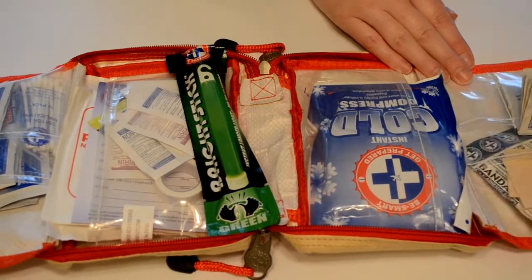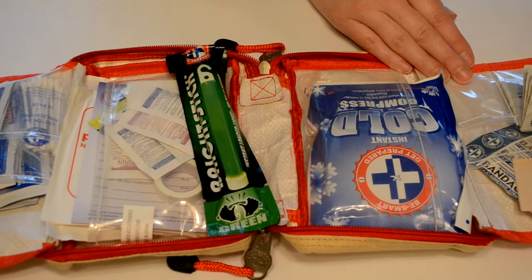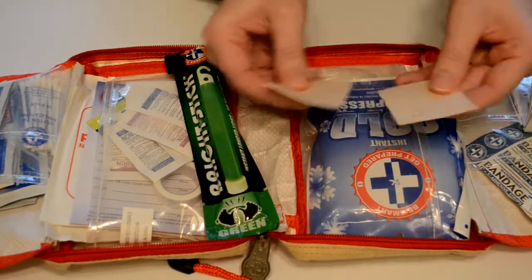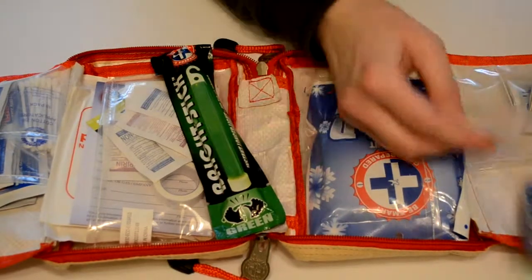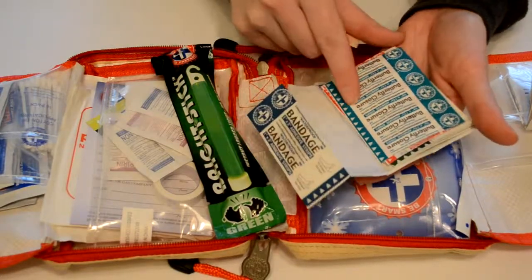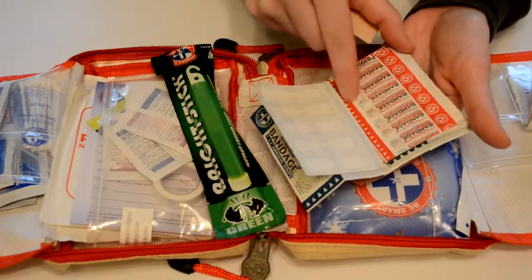We've got some single-use bandages here that look like they're just a whole patch that are adhesive. We've got different sizes of bandages here that are waterproof, and we have the butterfly closures.